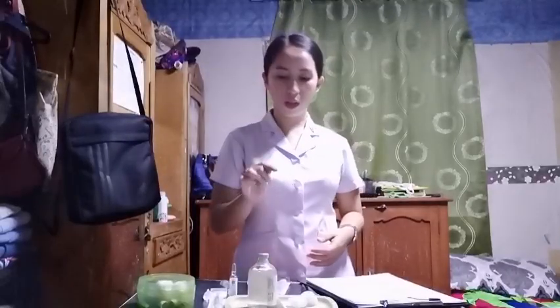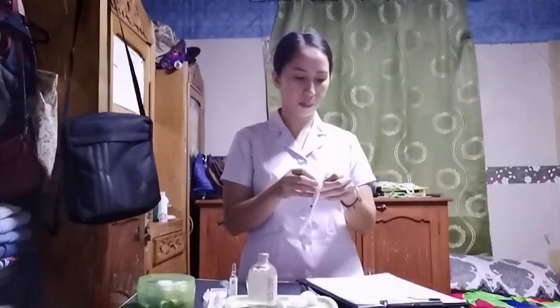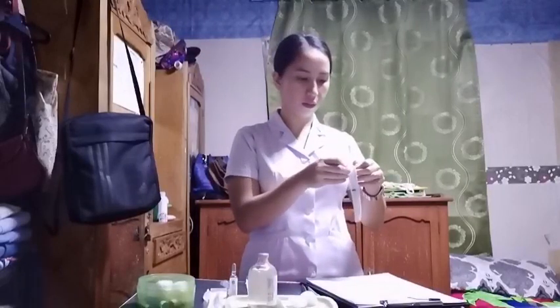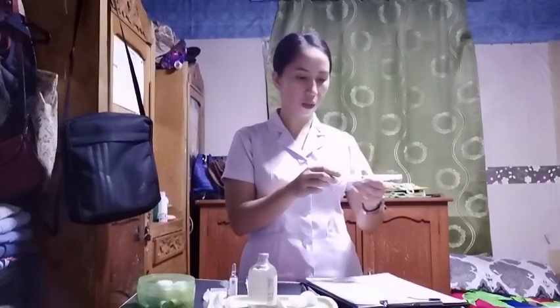Now that we have the exact dosage needed, we can now draw the medication from the medication vial, and of course we need a syringe with the gauge 23 needle, and let us open this. Always remember that we can only touch the barrel and the plunger of the syringe, and I'll have to separate first so that I can connect the syringe into an aspirating needle to draw the medication.